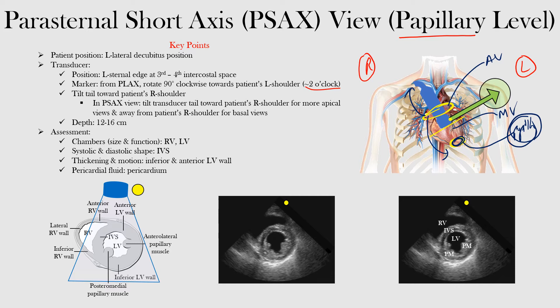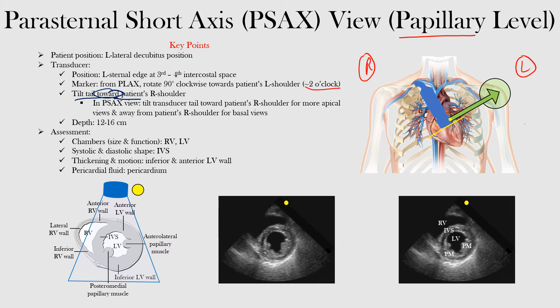That's what we're doing here. If we wanted just the mitral valve level, we would keep it perpendicular to the patient's chest. In this case, we want more of an apical level, and we are going to tilt it towards the patient's right shoulder — tilting the tail towards the patient's right shoulder in order to get this. The depth can be between 12 and 16 centimeters, and you may then adjust it based on the patient.